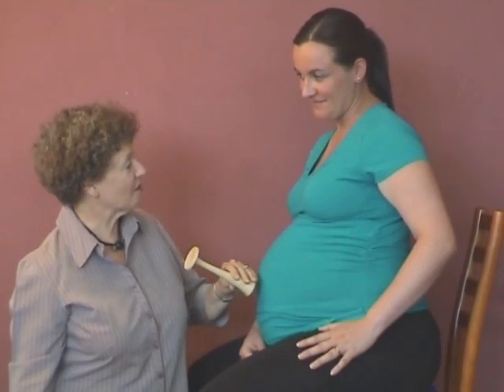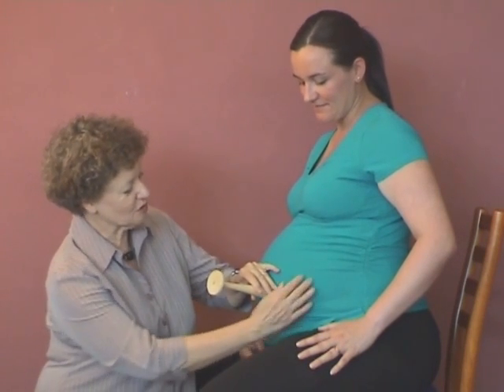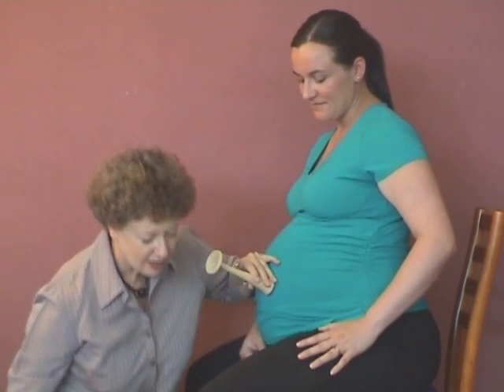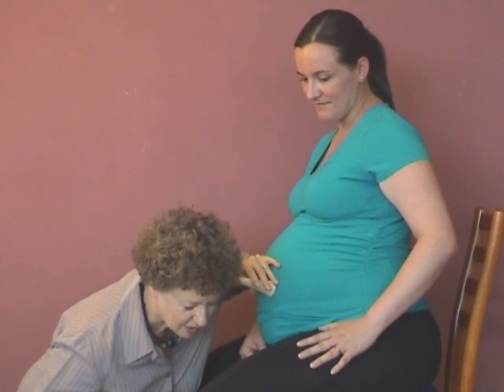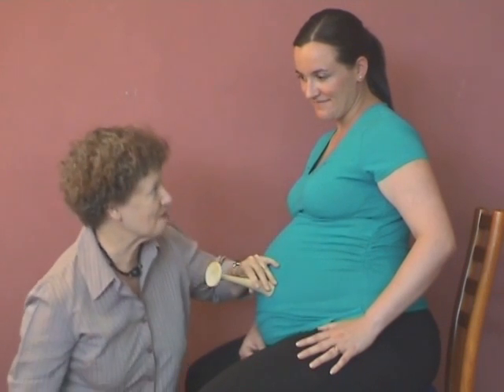This is how the midwife would use it during labour. She'd locate where the baby is through feeling your tummy. Then she'd put the Pinard on and listen to what the baby's doing. That's a happy baby.